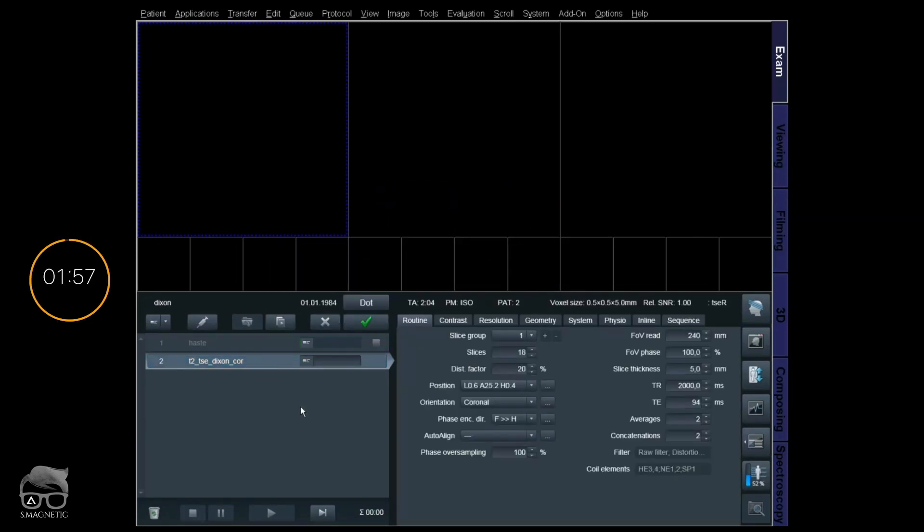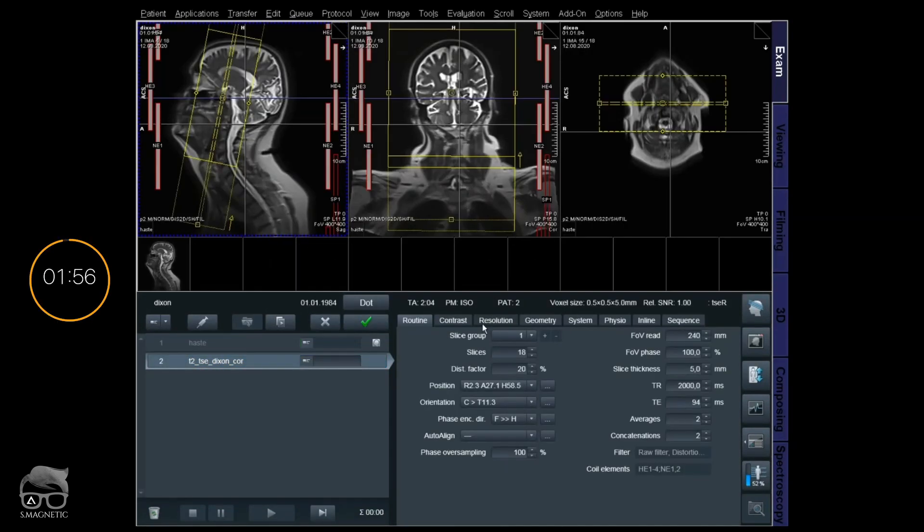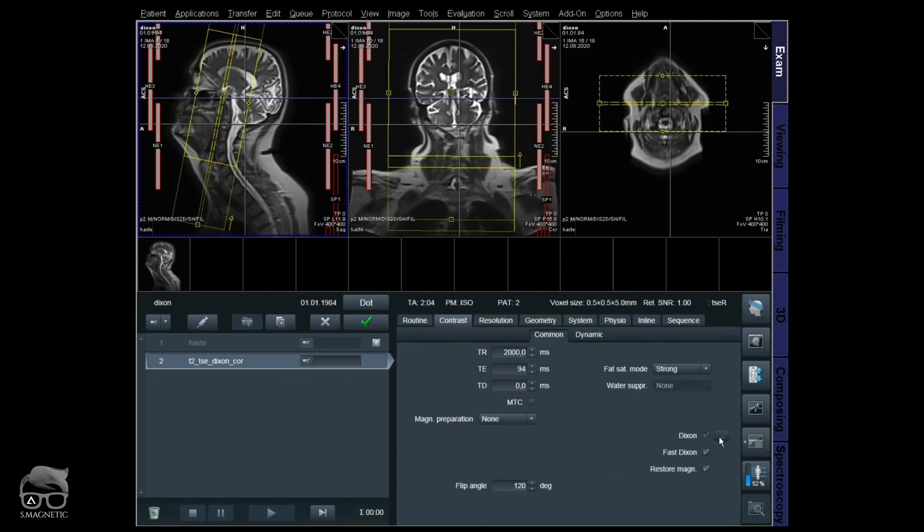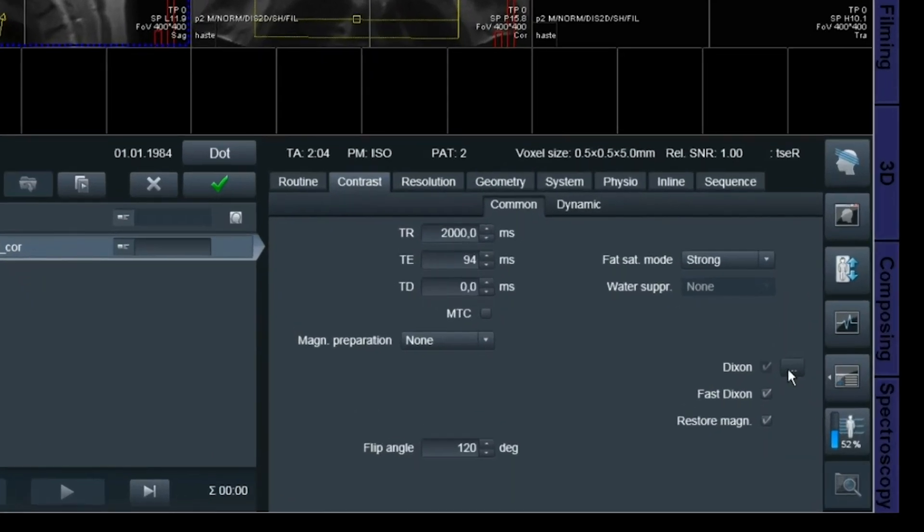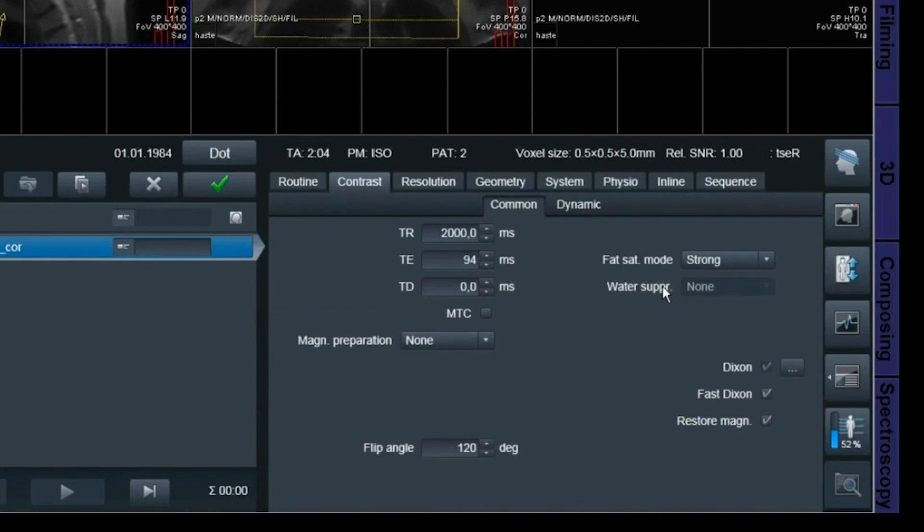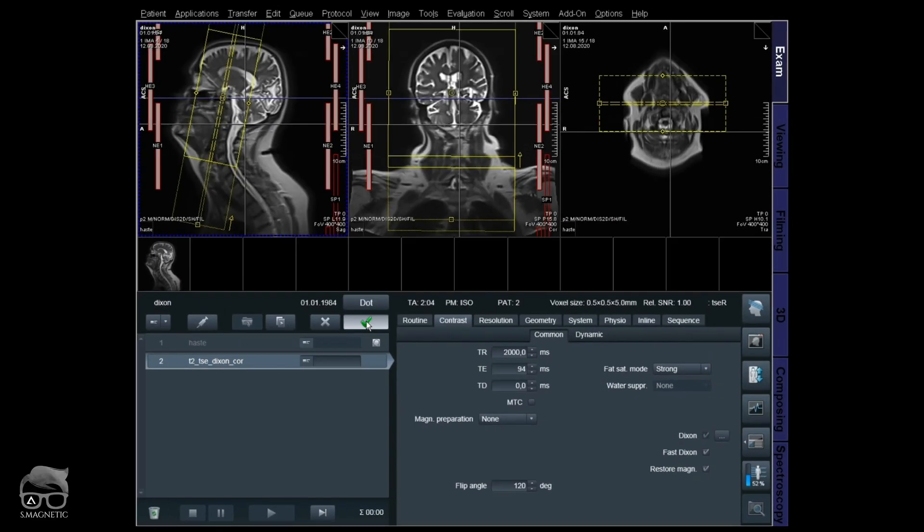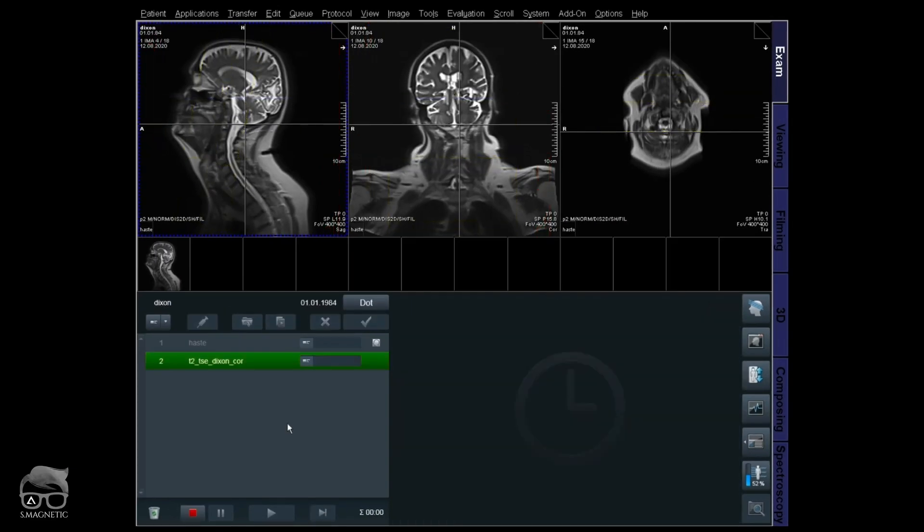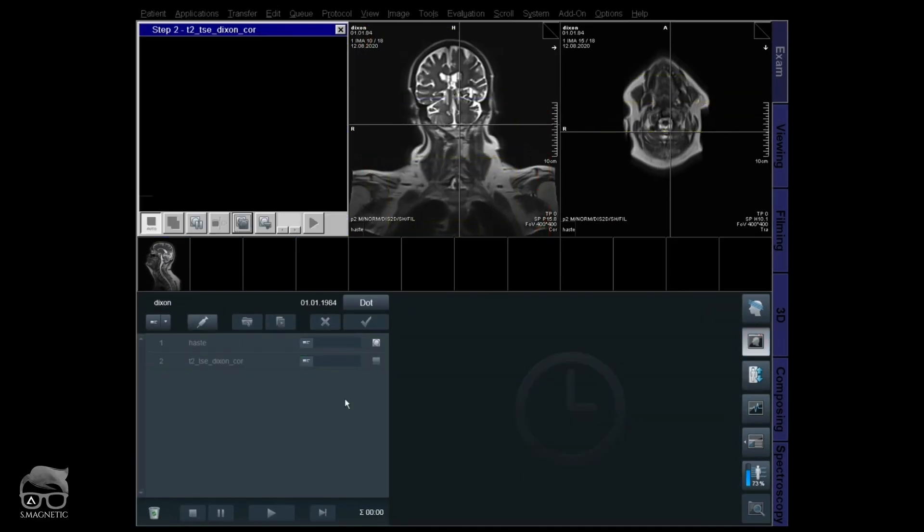So what I'm going to do here now is demonstrate a standard coronal T2 Dixon. In here at the contrast card, common and then Dixon, you have the options to choose between original echoes, which means in and out of phase, and water only and fat only. So let's say you forget to have original echoes or you don't want it, but then suddenly you do the scan and you regret and you want it because the radiologist suddenly wants to have the original ones. So let's scan there.